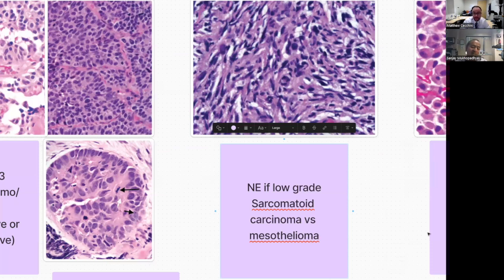This is my personal opinion: I don't think any degree of GATA3 staining or WT1, anything, overrides an intraparenchymal lung mass. On the other hand, if it is pleural, with multiple pleural lung nodules and an appropriate clinical setting, an elderly man, unilateral, I think no immunostain, other than TTF1 maybe, will change my mind that this is likely a sarcomatoid mesothelioma.